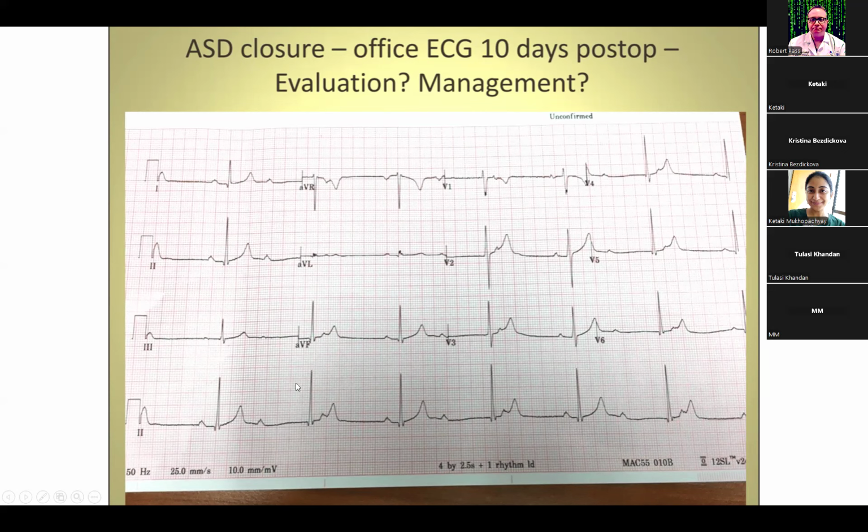On the other hand, one of the things that's in favor of the diagnosis of complete block is the fact that the R to R interval is not varying at all. Usually, when patients have high-grade second-degree block, there may be occasional atrial capture with AV nodal conduction with capture of the QRS. So, yeah, I think this is complete heart block.